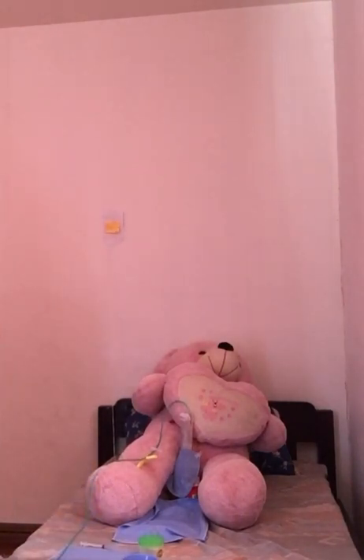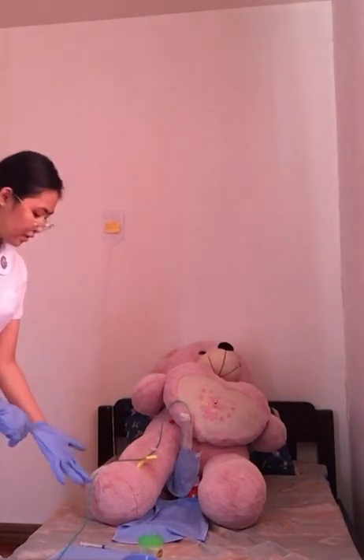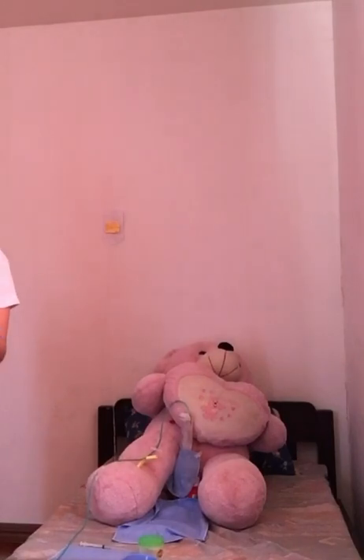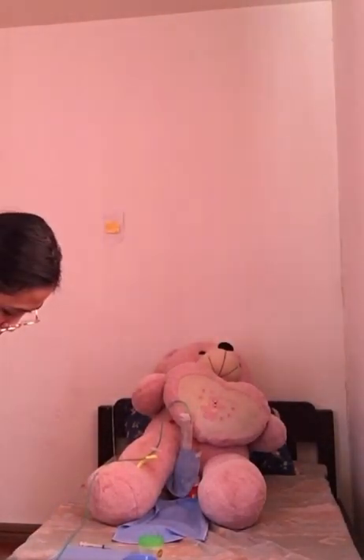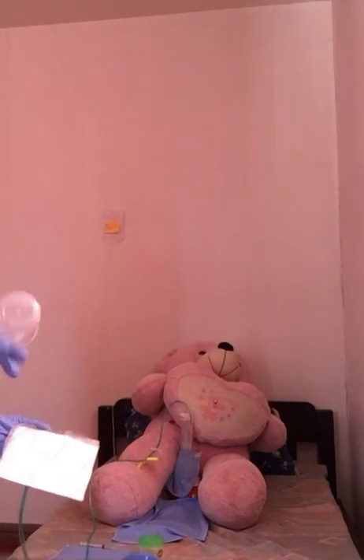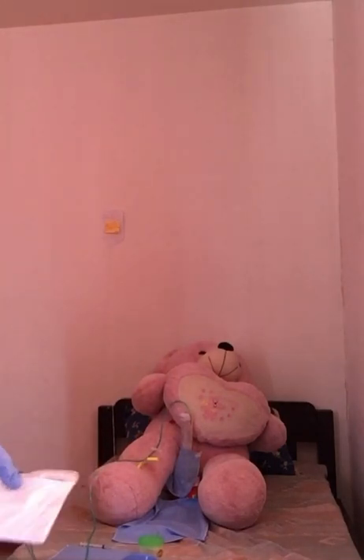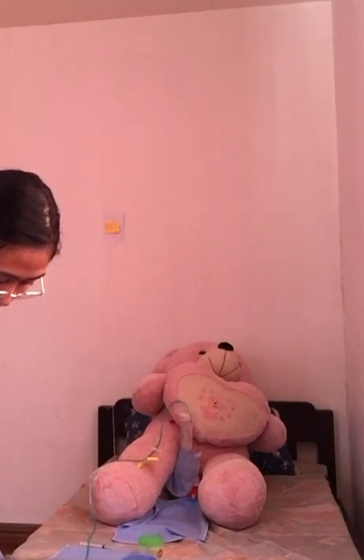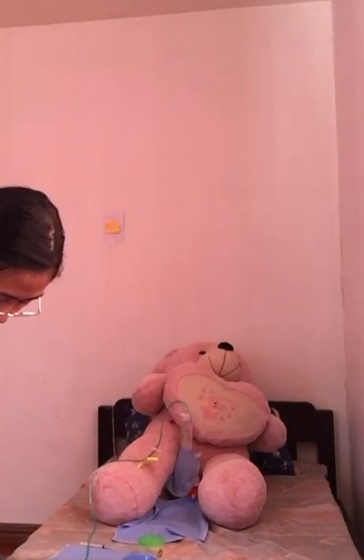We need to put on our gloves and then empty the drainage bag and measure the amount of our urine. So this is our drainage bag, and this is our metric container, and then we will be collecting the urine, and we need to note the amount and the characteristics of the urine.